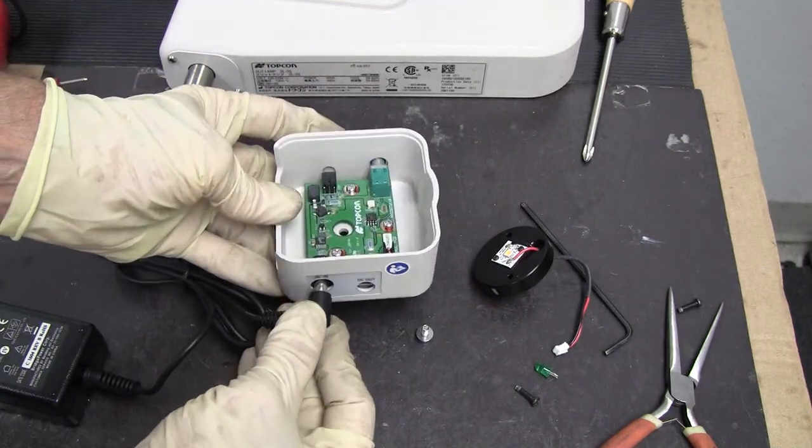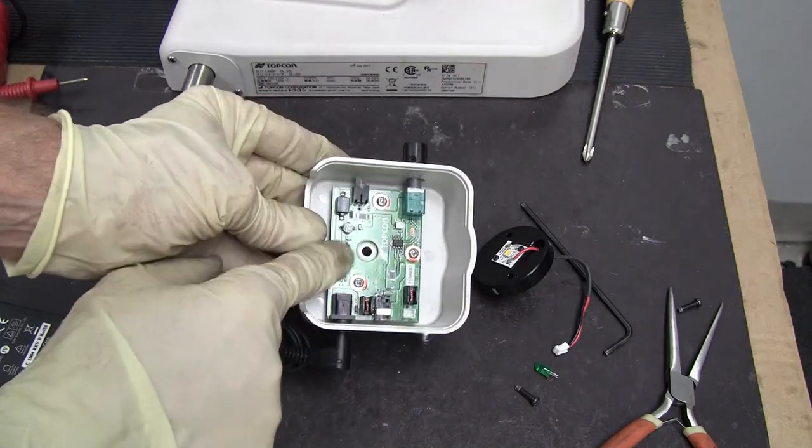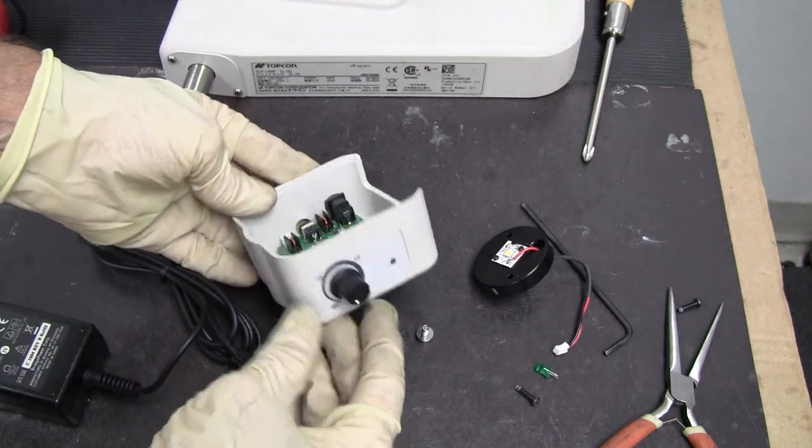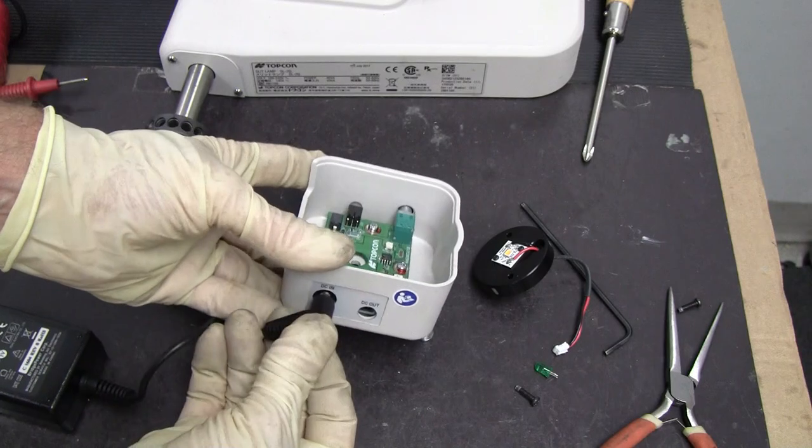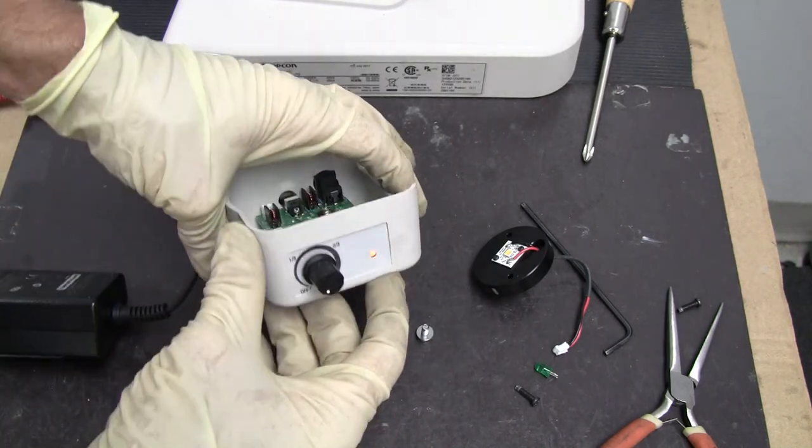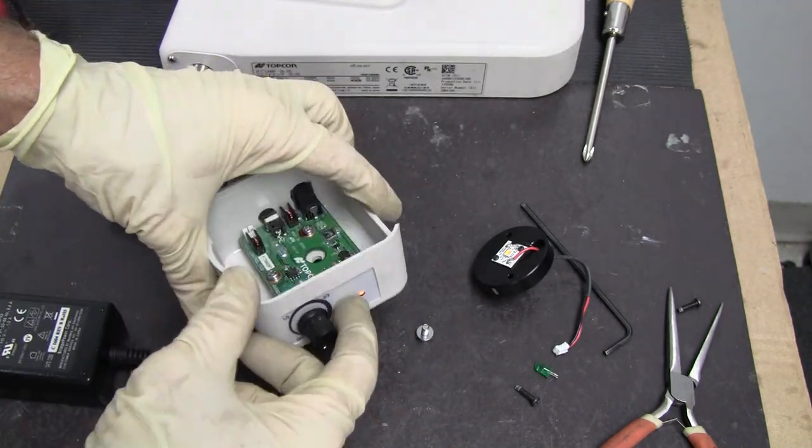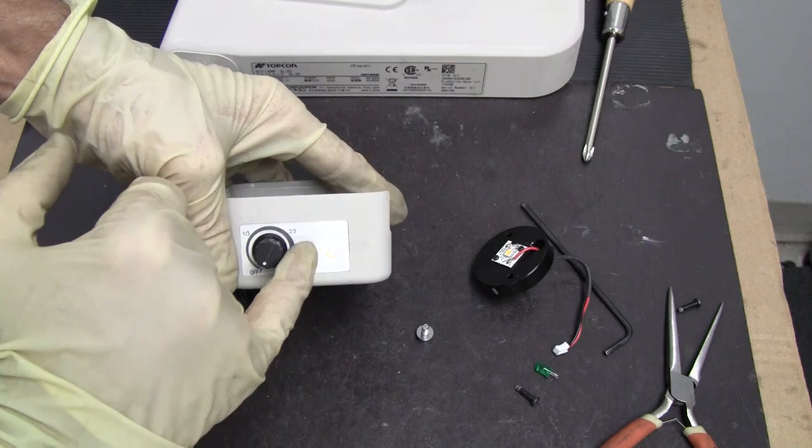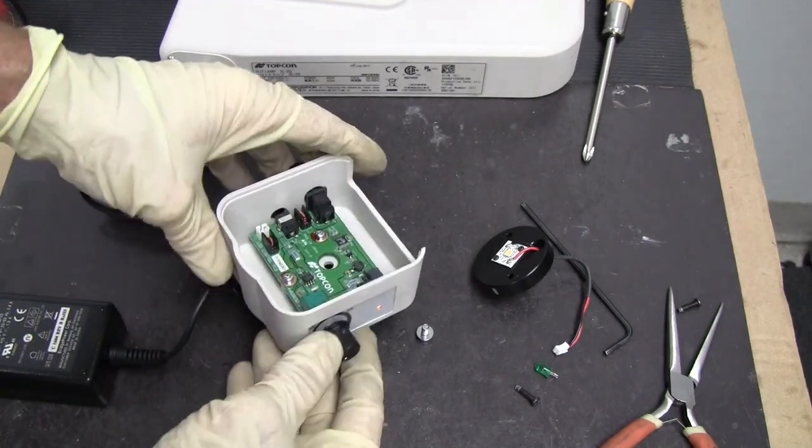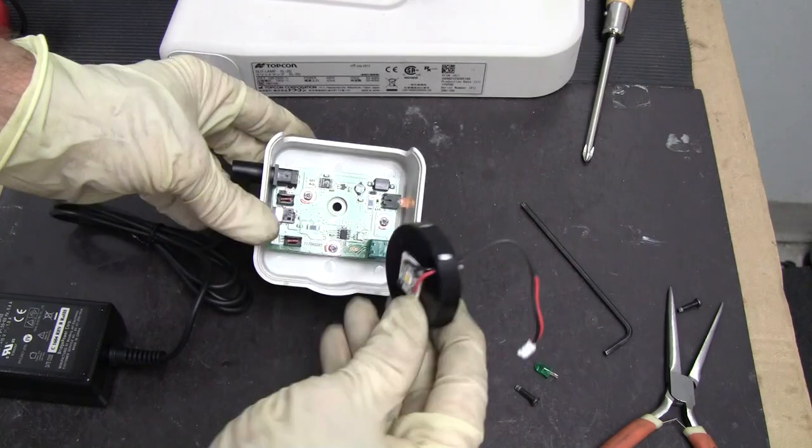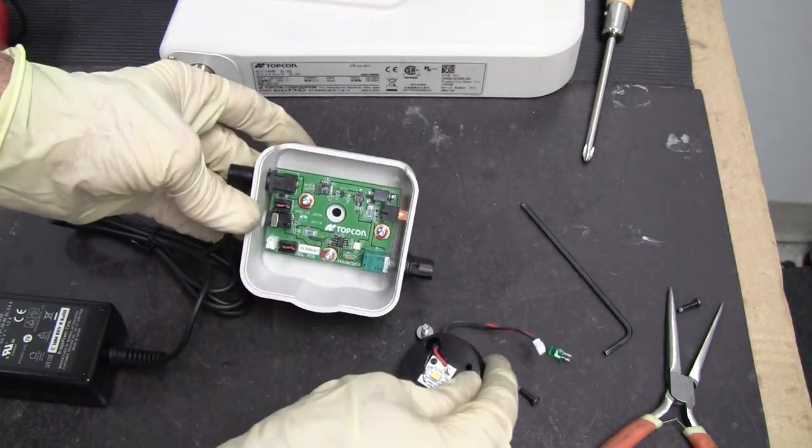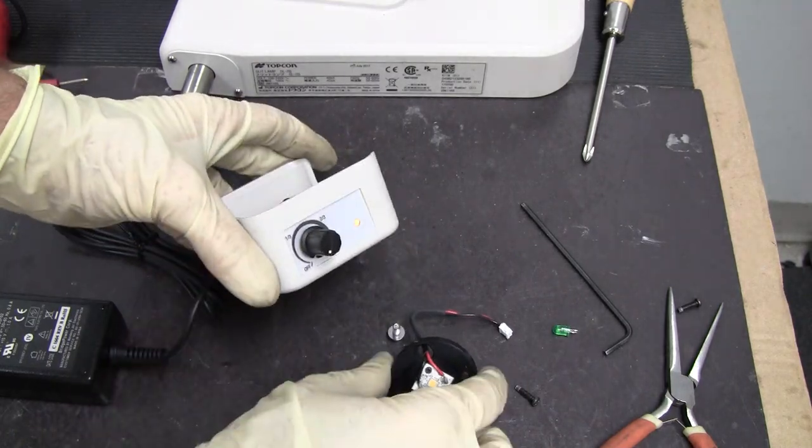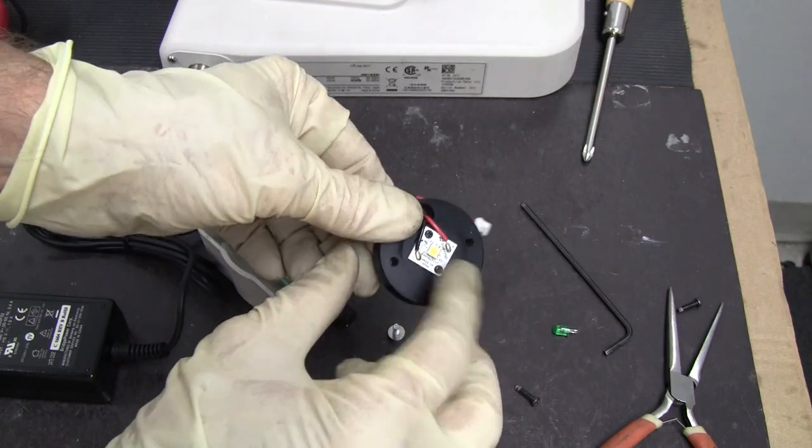When you apply power to this PCB board, the external LED indicator should turn amber, yellow. That's regardless of whether you have the LED plugged in or not. So if you're not getting any light, it doesn't matter if this is bad or not.